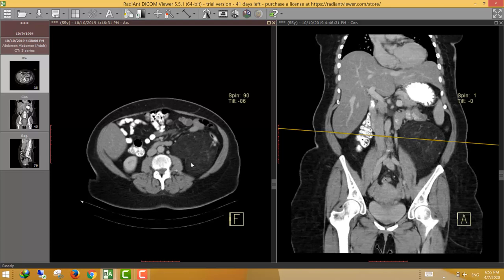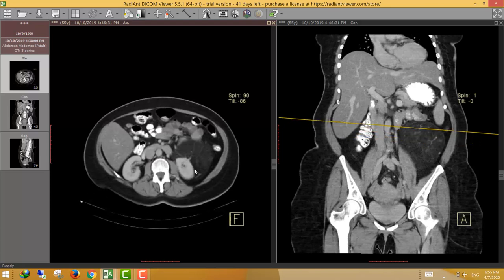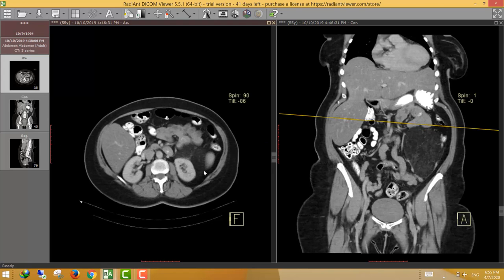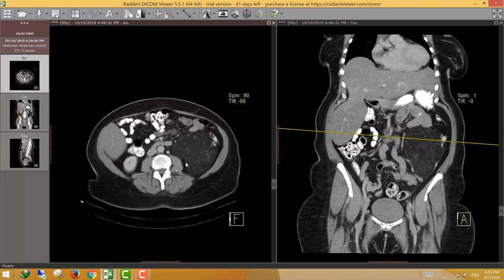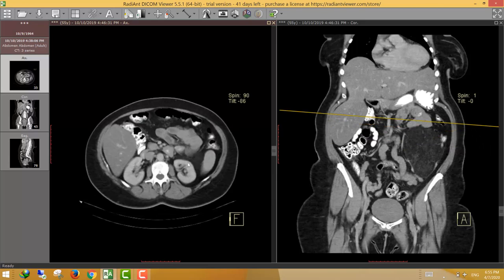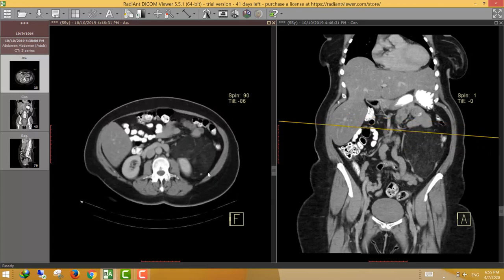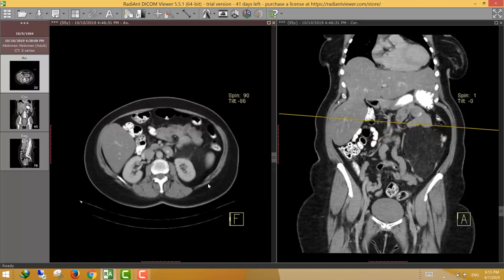Here is an example of retroperitoneal liposarcoma: a fairly well-defined predominantly fatty lesion displacing the descending colon anteriorly, abutting the psoas muscle and the anterior aspect of the lower pole of the left kidney, with traversing vessels and non-fatty elements — characteristic of retroperitoneal liposarcoma.